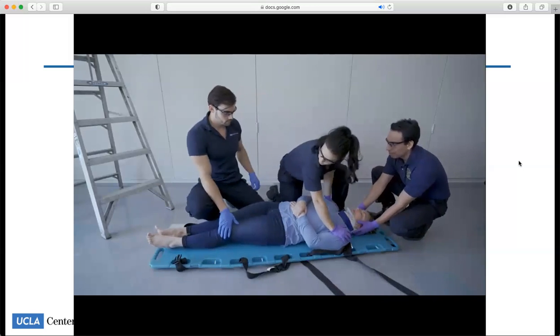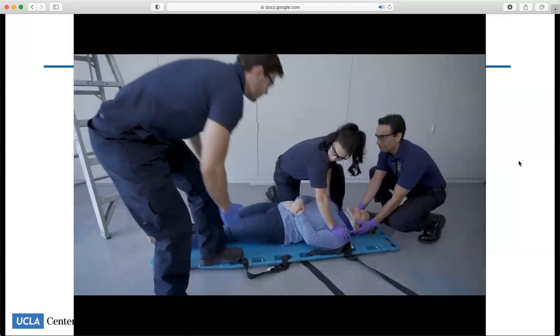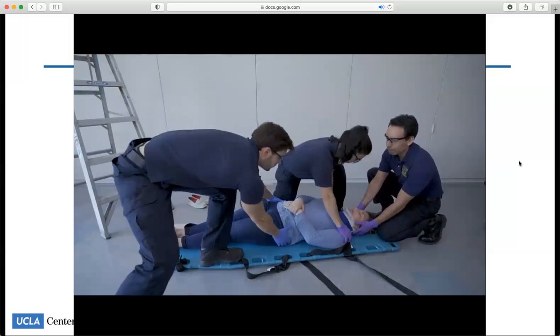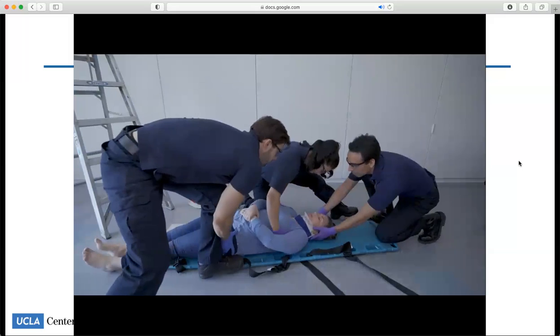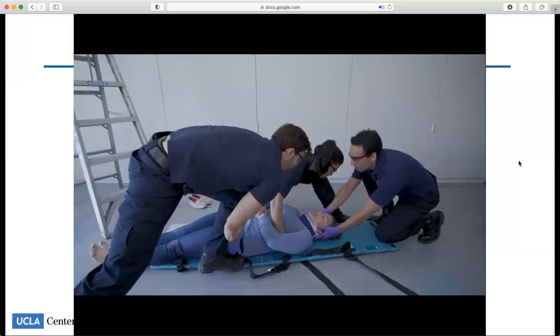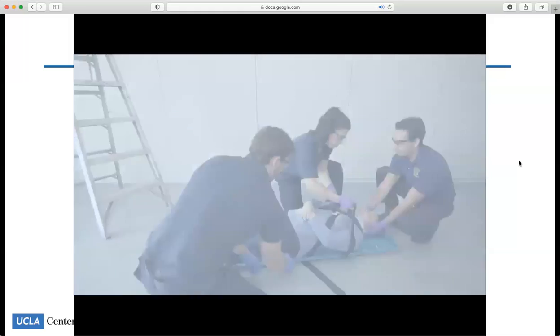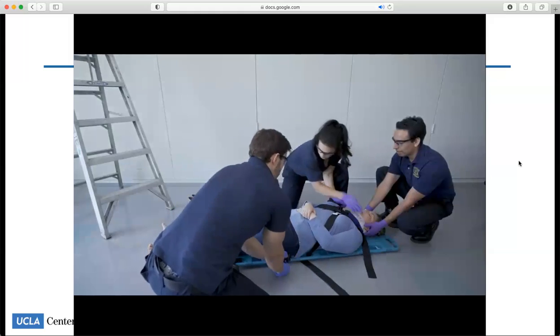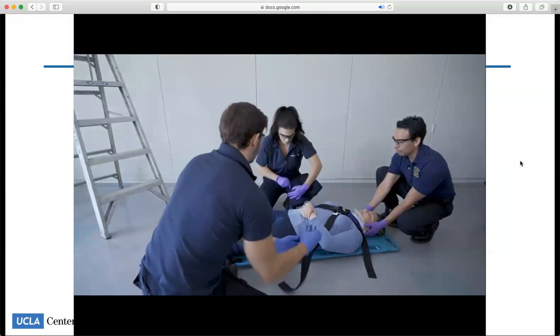The patient will need to be moved up and down to ensure he or she is secured to the center of the board. This will mean the person holding cervical immobilization directs the team in sliding the patient down and towards the center of the board and then back up, so then the patient's head is at the top of the board. I will start by securing the patient's torso and hips to the long spine board, followed by the patient's legs.